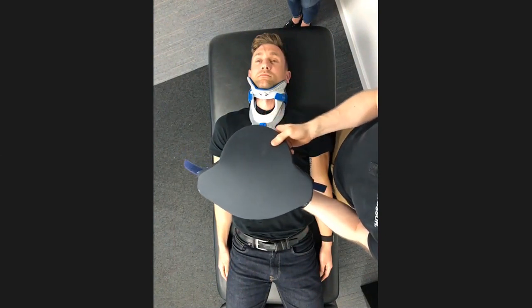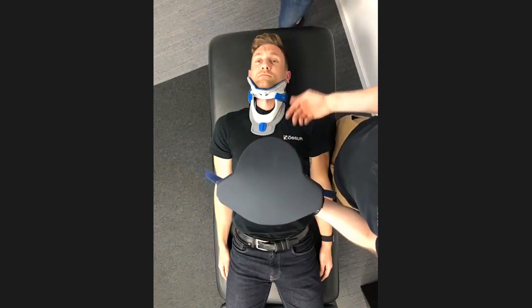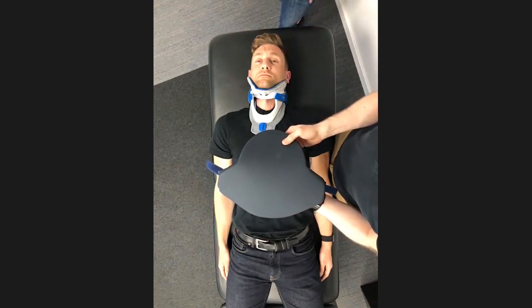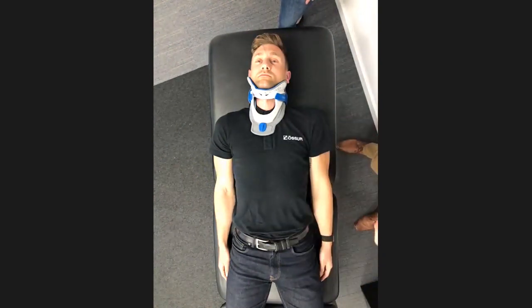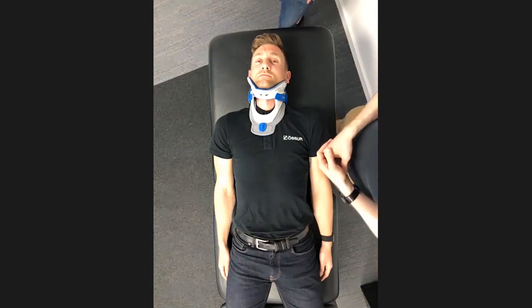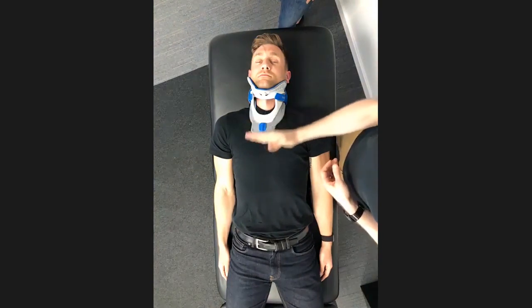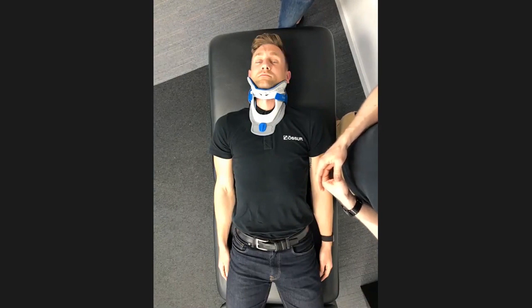This fits in exactly the same way as we do with the standard back, and it should be used when the patient's lying supine or up to about 45 degrees. So we would then remove that. In its standard configuration, the Miami Select, as with other hard collars, is controlling between C2 to C5. However, we can fit a thoracic extension, the Miami JTO, if needed, in order to set that up.